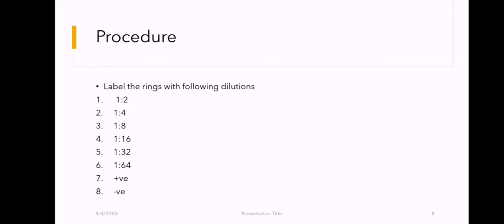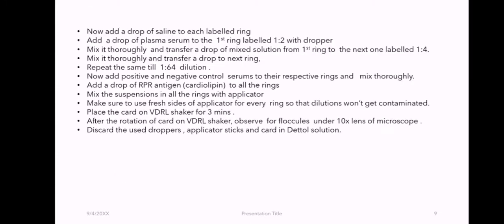Procedure: Label the rings with the following dilutions — 1:2, 1:4, 1:8, 1:16, 1:32, 1:64, positive, and negative. Add a drop of saline to each labeled ring. Add a drop of plasma or serum to the first ring labeled 1:2 and mix thoroughly. Transfer a drop of the mixed solution to the next ring labeled 1:4. Repeat this serial dilution until reaching the 1:64 dilution.